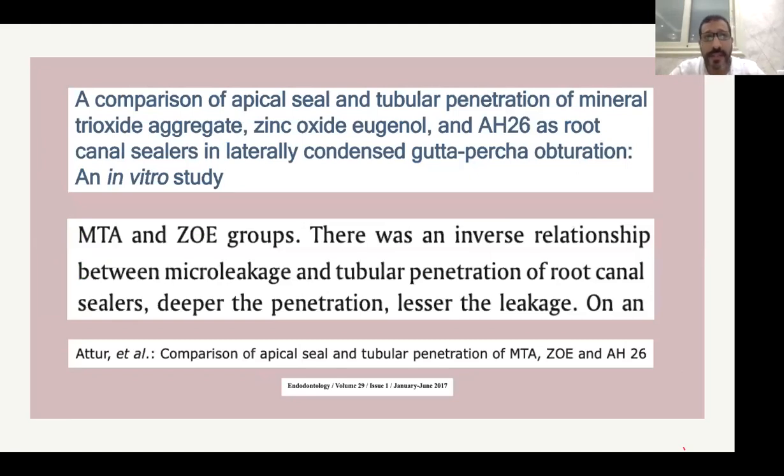Among the sealers that were used and are still being used nowadays is the resin sealer, and we have multiple modifications, starting with second generation, third generation, and nowadays the methacrylate-based sealers, a fourth generation, are available in the market. There is no conditioning that you need like before. There is no acid etching of the root canal system like before. That's why using an adhesive sealer inside the root canal system is very powerful to obtain a perfect seal of the apical side of the root canal, especially with improving the physical, chemical, and biological properties of this resin sealer.